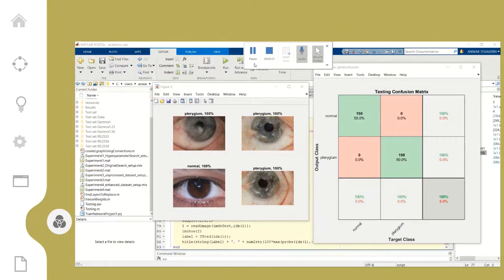Here, figure 2 shows an example of the images that have been classified. Nicely done, all shown images are classified with 100% accuracy. The confusion matrix also shows there are no misclassified images. Hence, the model achieved the perfect score.